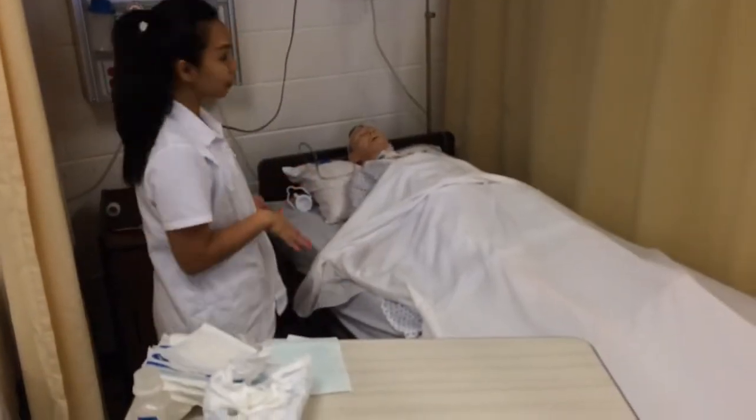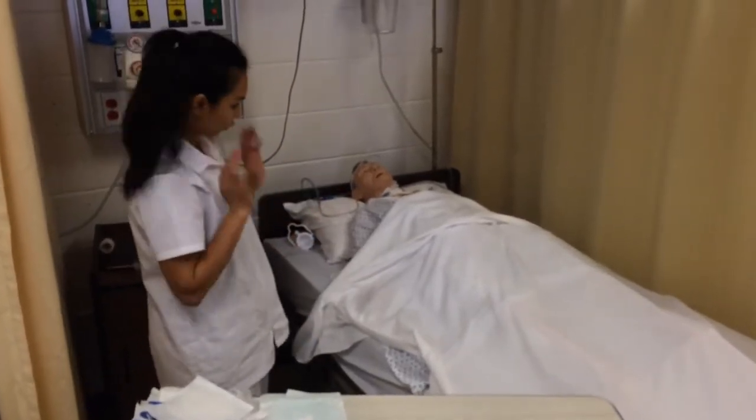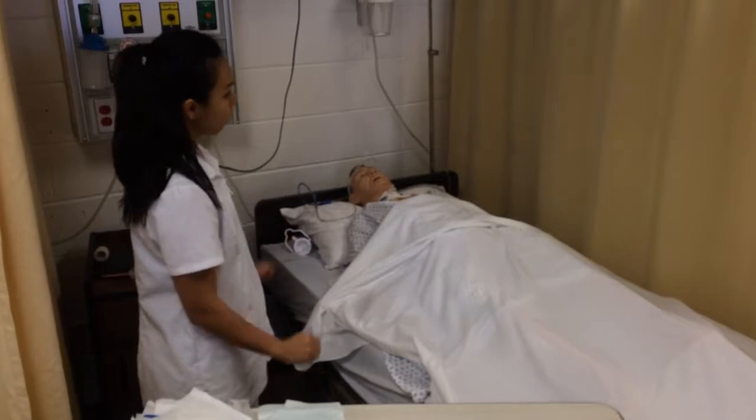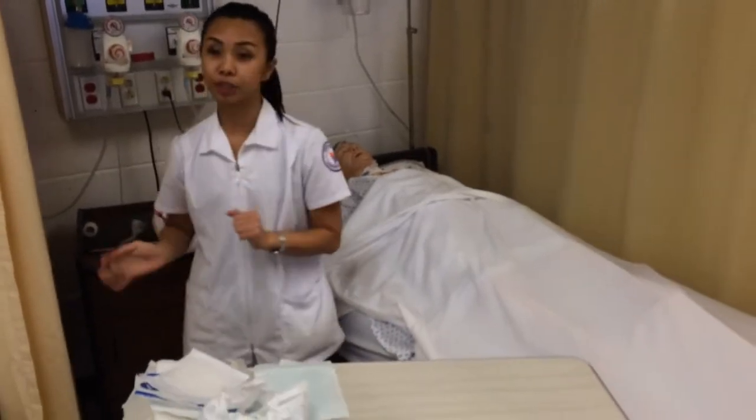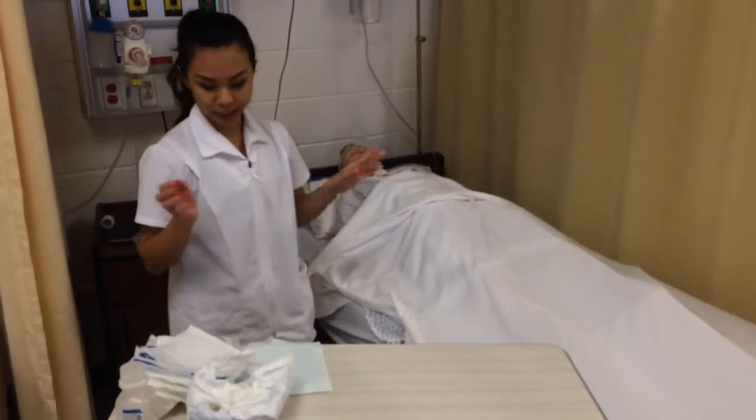I come to the patient, I raise the bed up to working height, and lower the bed rail down. After I wash my hands, I am going to take off the old dressing.